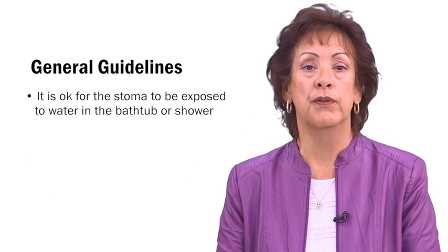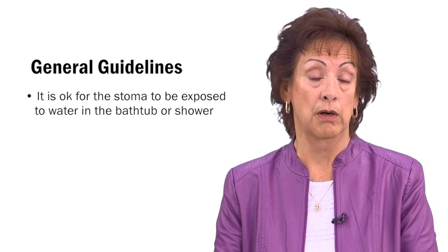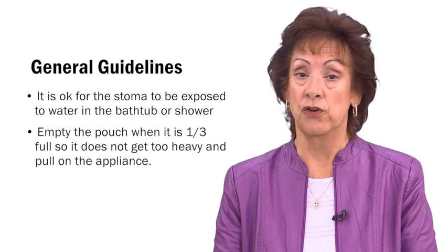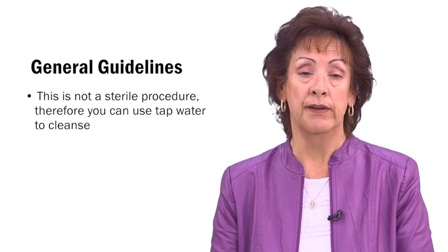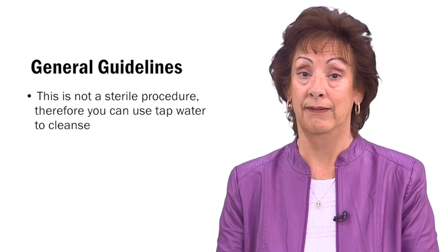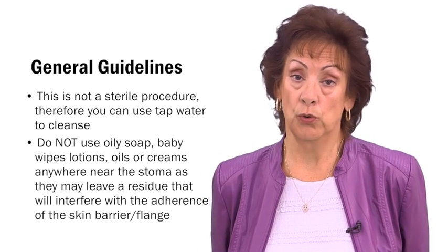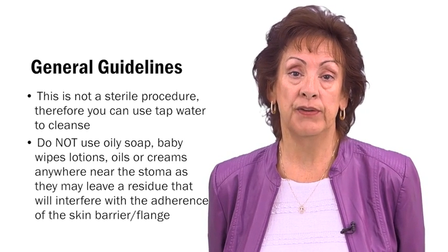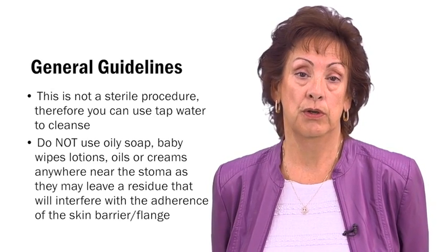It is okay for the stoma to be exposed to the water in the bathtub and shower. Empty the pouch when it is about 1/3 full so it does not get too heavy and pull on the appliance. This is not a sterile procedure, therefore you can use tap water to cleanse. Do not use oily soap, baby wipes, lotions, oils, or creams anywhere near the stoma, as they may leave a residue that will interfere with the adherence of the skin barrier flange.